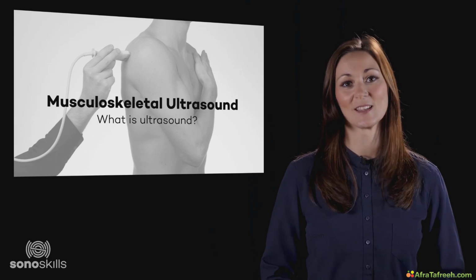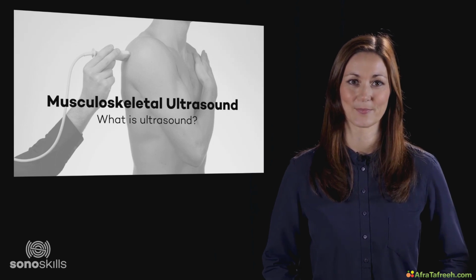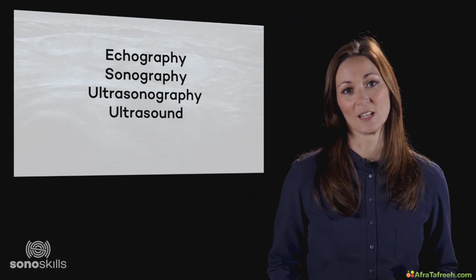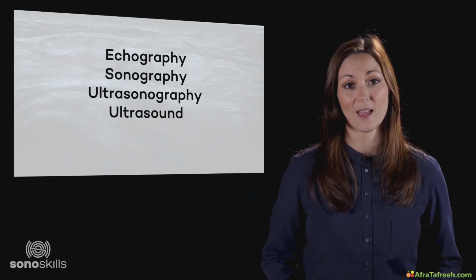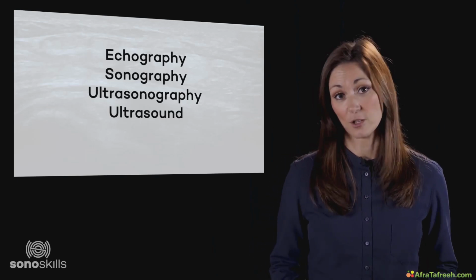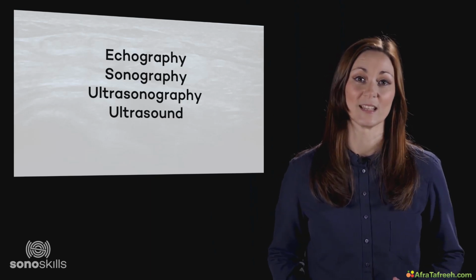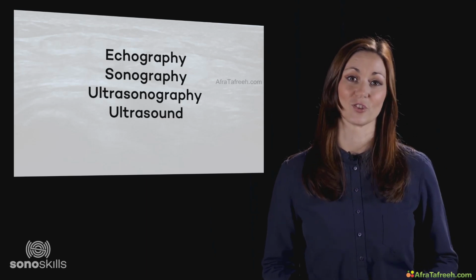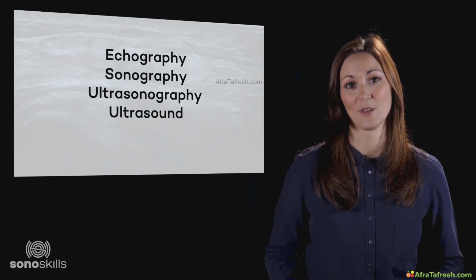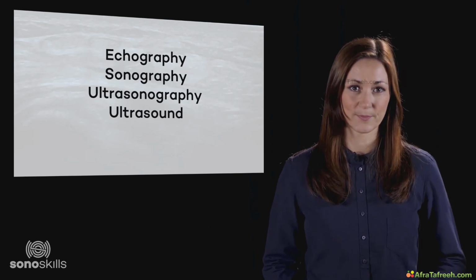The goal of this presentation is to give you a better insight into exactly what musculoskeletal ultrasound is. If you were to search the literature for information, you might find several synonyms. For example, echography, sonography, ultrasonography, and ultrasound. These words all describe the same thing: the medical imaging technique that is capable of visualizing soft tissue structures in order to capture their size, structure, and function with real-time imaging. In this course, we will use the word ultrasound.